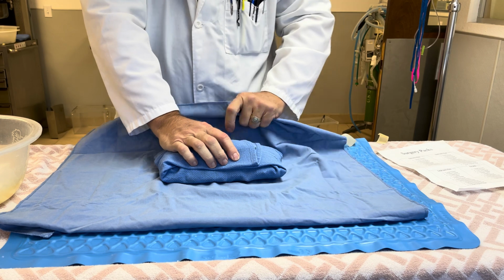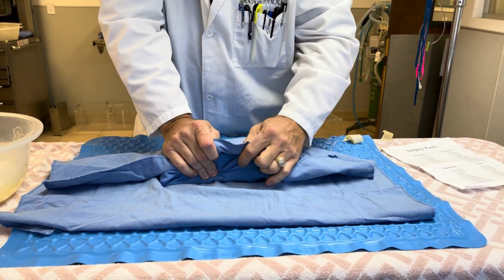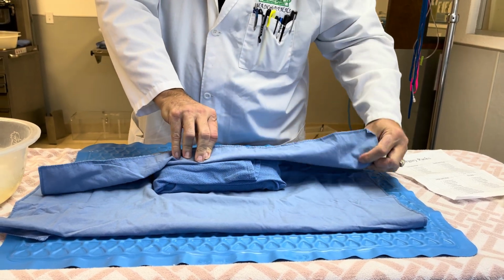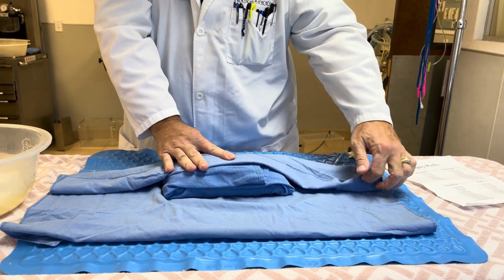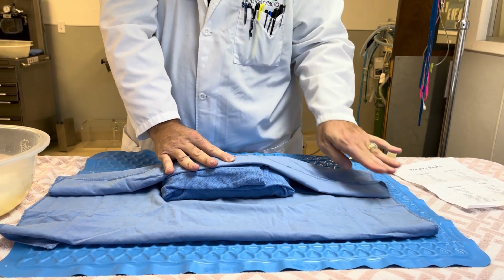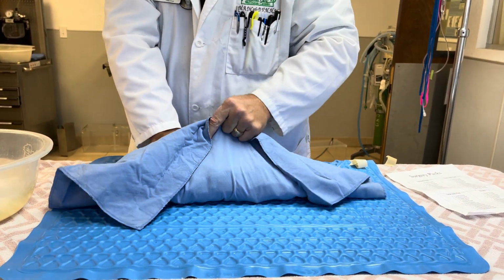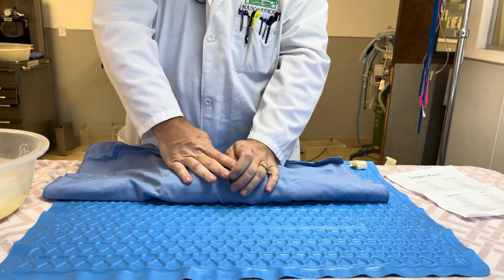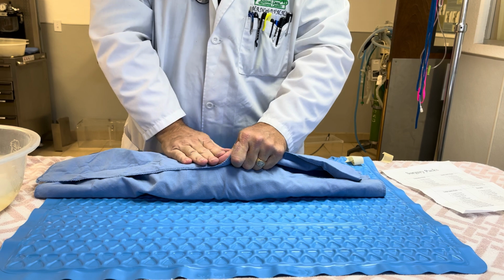Now, your outer wrap, you want to continue with keeping this nice and tight, okay? So you want to fold it and then fold it back like this. Understand? Not just all the way over like this, because this creates a sterile spot for the doctor to grab it when he or she opens the pack. So then you pull this also over, and you're going to do the same thing. You're going to fold it back.